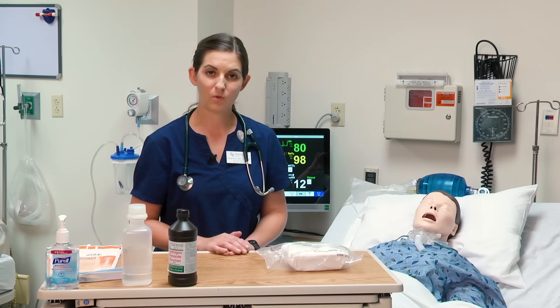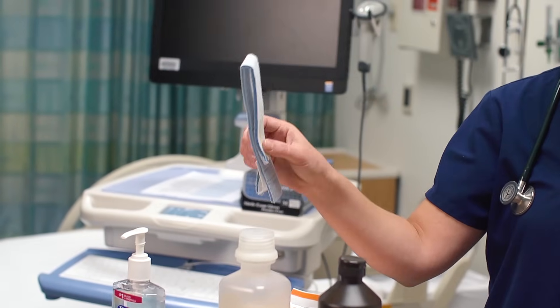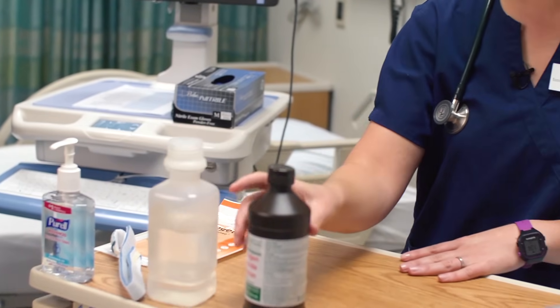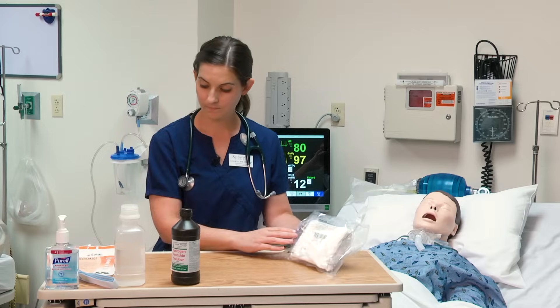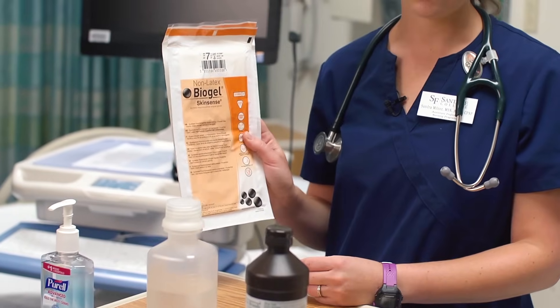The supplies you need to perform tracheostomy care include a new set of trach ties or a trach collar, some sterile normal saline, hydrogen peroxide for cleaning, a sterile tracheostomy kit, and two pairs of sterile gloves.